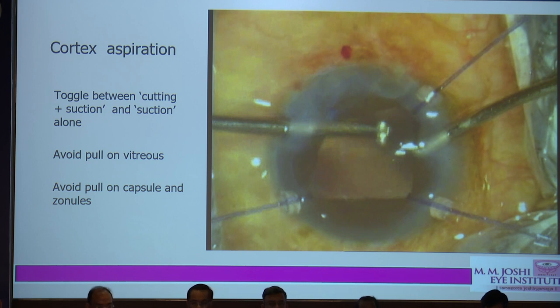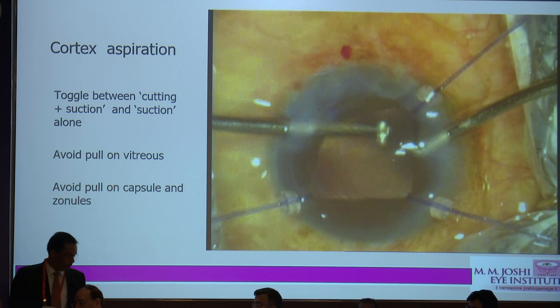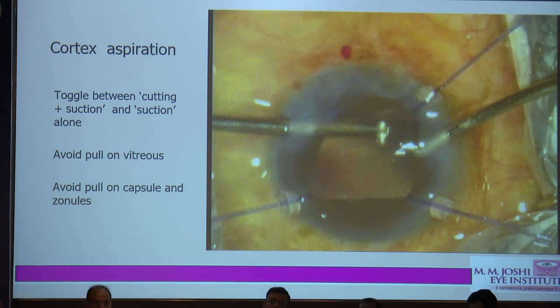Some vitreous strands keep sticking at the wound or wherever. And next day morning, oh my God, such a nice surgery, but I still see a pupillary peaking. So that's the most common finding, the most common thing which we always come across. So please do not hesitate to use it, but please use it diluted.